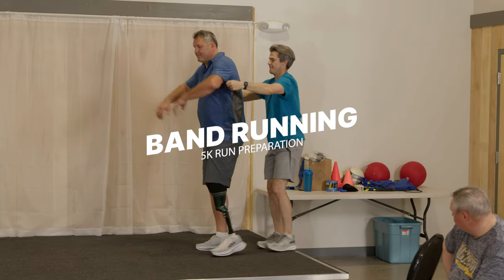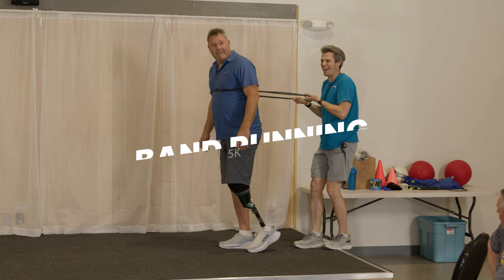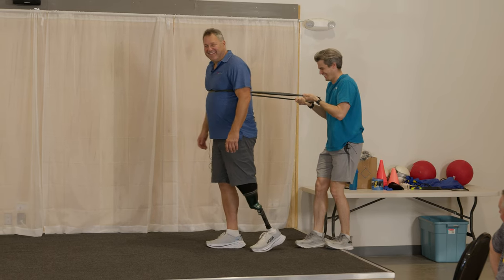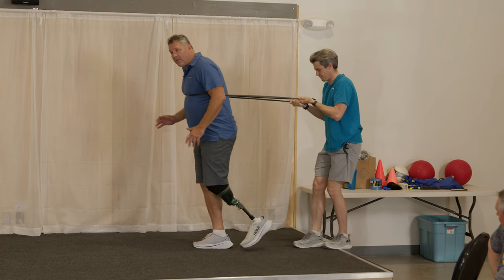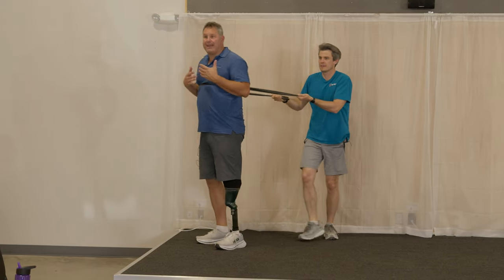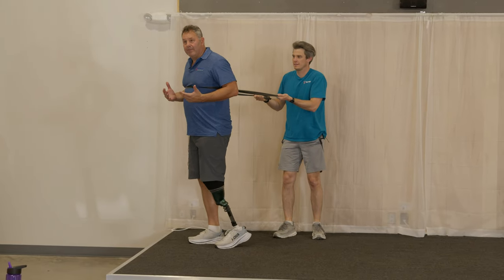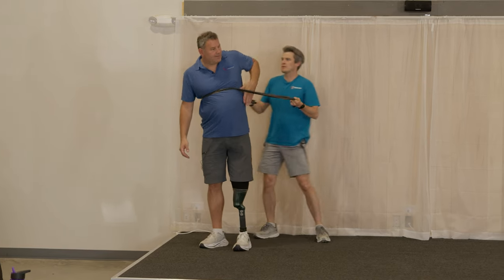You guys are gonna love this — mainly because you get to drag Nate around. We're gonna get you on your toes, like we were doing against the wall, and just get going like this. You'll be able to use the resistance of the band to keep your weight forward but not have to worry about falling forward. It's not about speed, it's about that position.